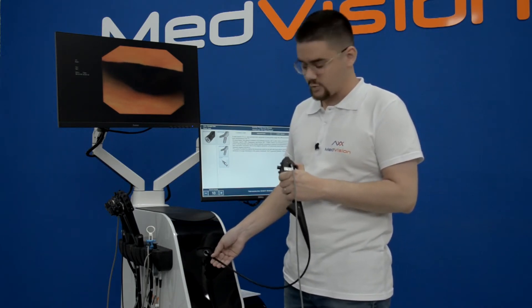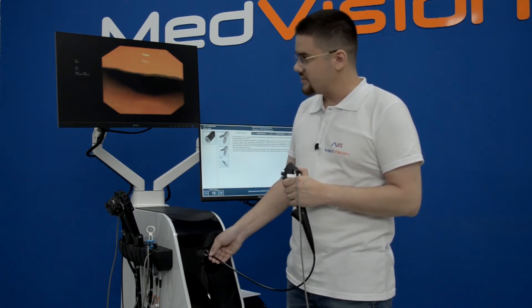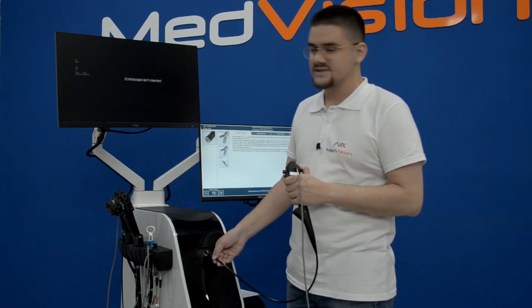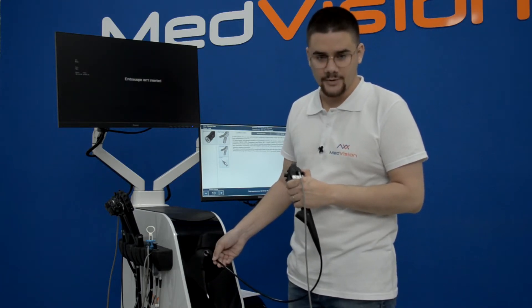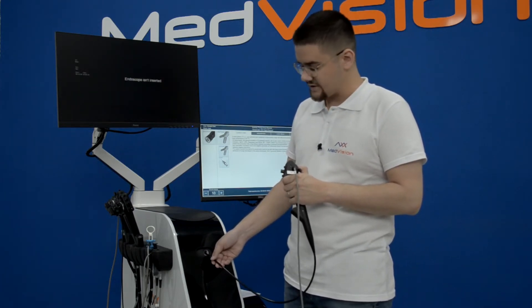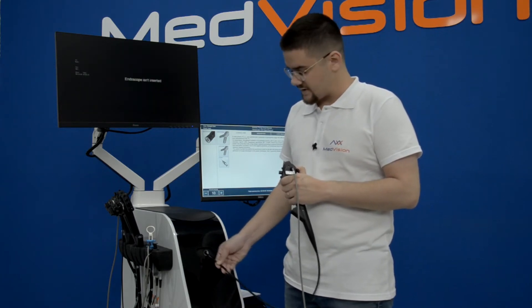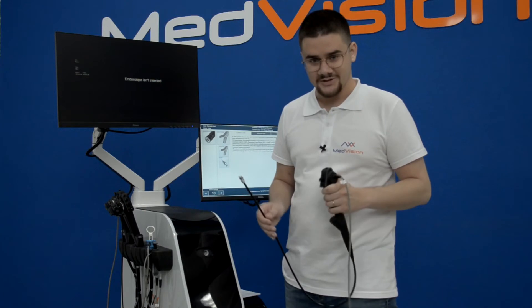Always be very gentle when operating the flexible parts of the instrument. When removing, pull it out gently and at some point you'll feel a slight resistance — this is where the holder is holding the instrument. Push it back a little further and it will release completely.